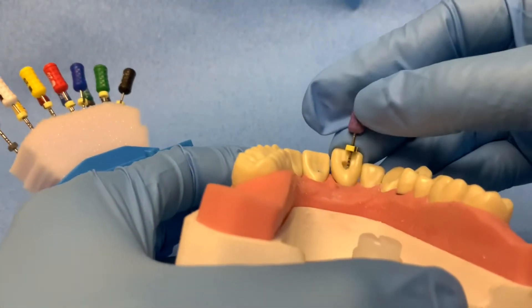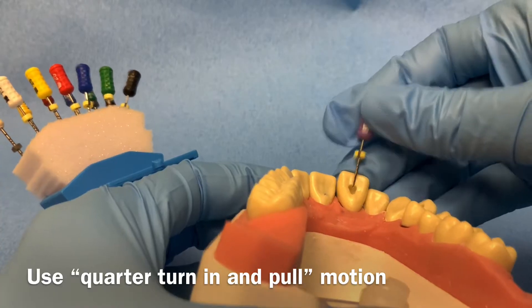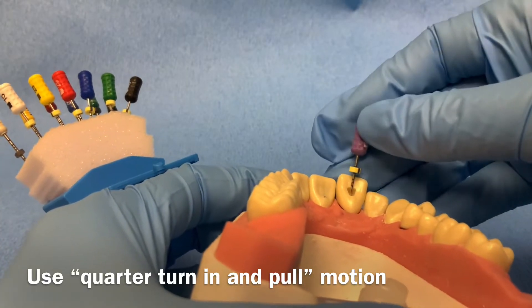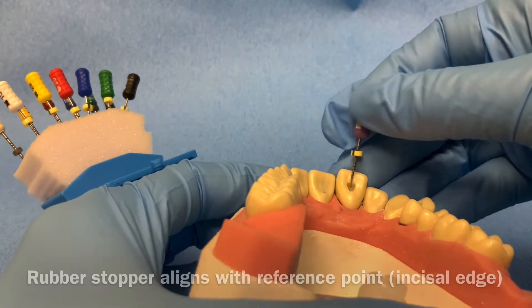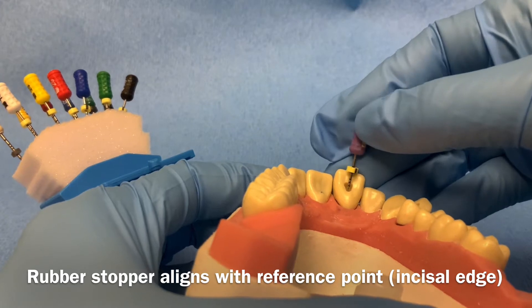Using the working length determined in the previous step, clean and shape using the quarter turn in and pull motion with a size 10 k-file until the file is no longer binding and has minimal resistance in the canal. The rubber stopper should align with the incisal edge and not go apical to it, which would result in over-instrumentation past the apex.